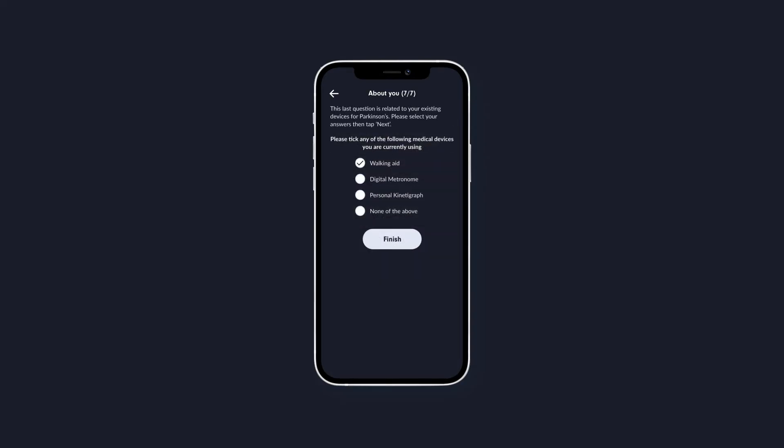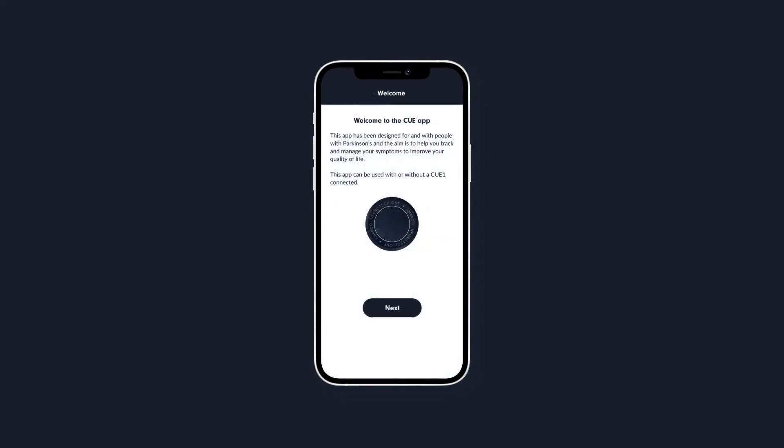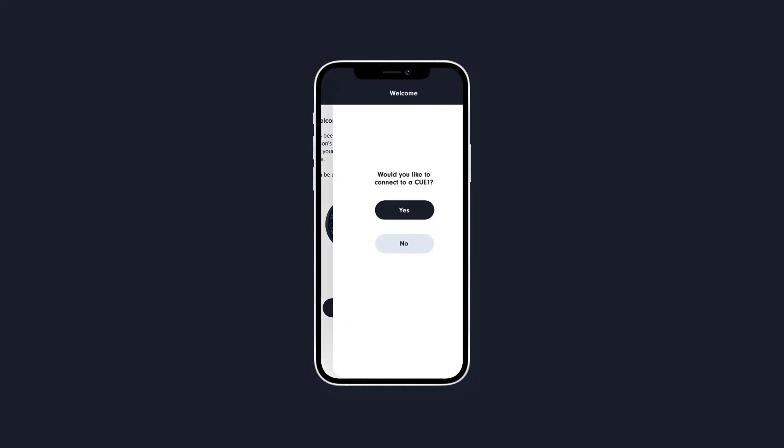After completing your profile, you'll be taken through some basic setup steps, starting on this page. When you tap next, you'll be asked, would you like to connect to a Q1? If you don't want to connect to a Q1, please tap no. If you are ready with your Q1, please tap yes.